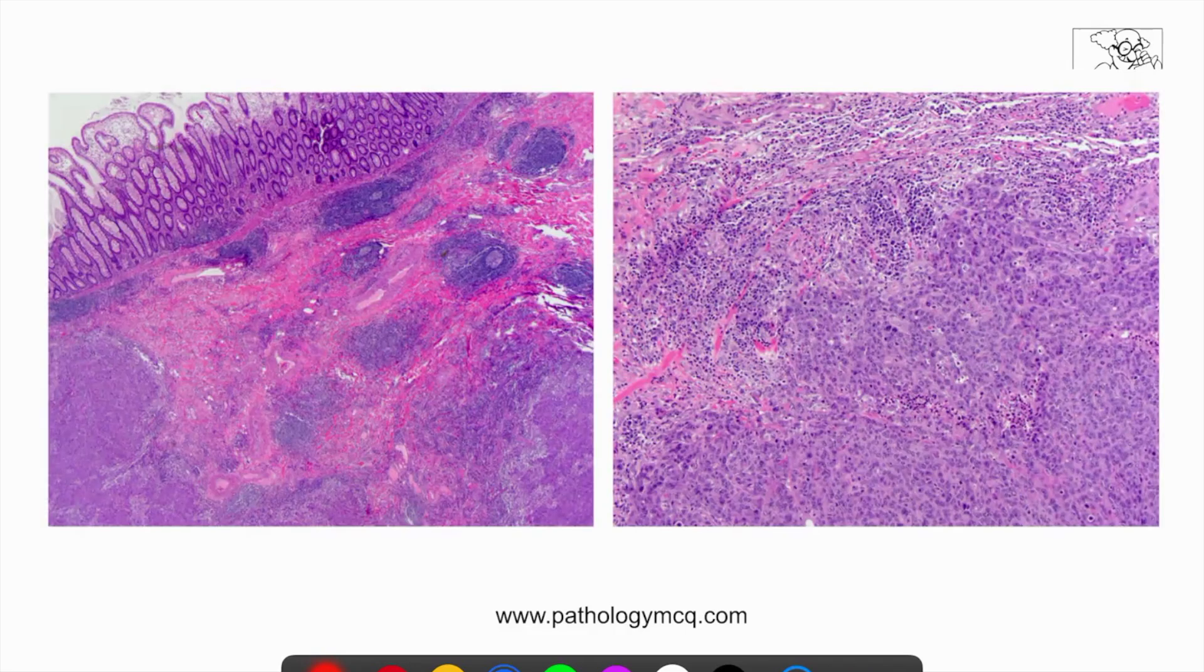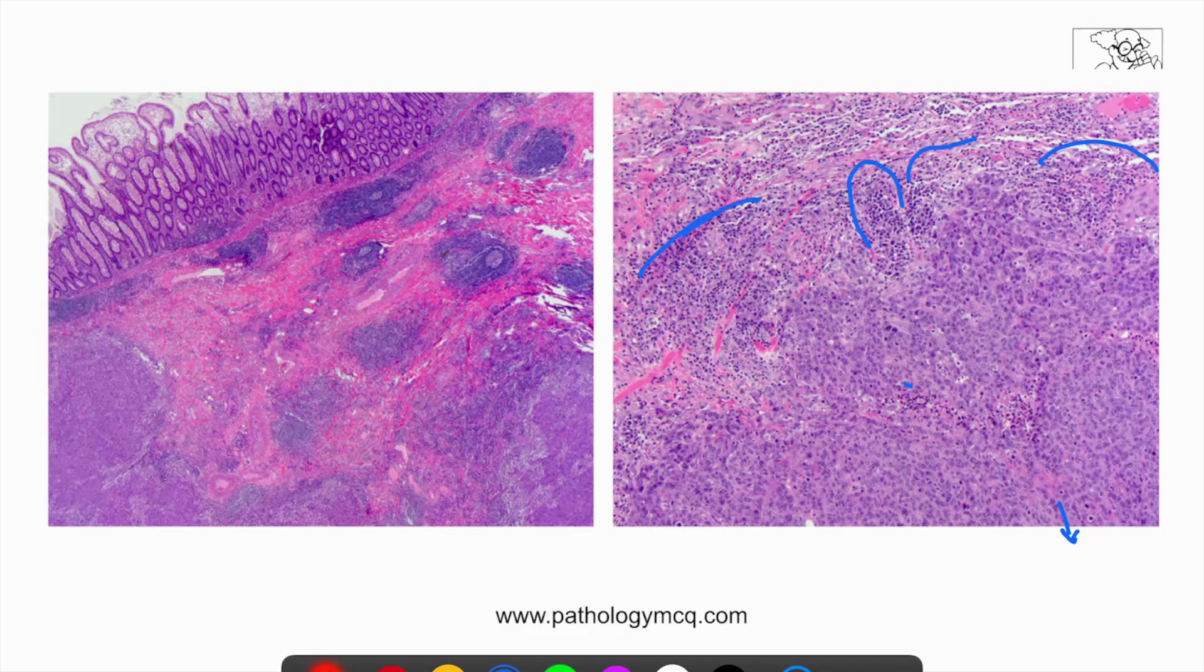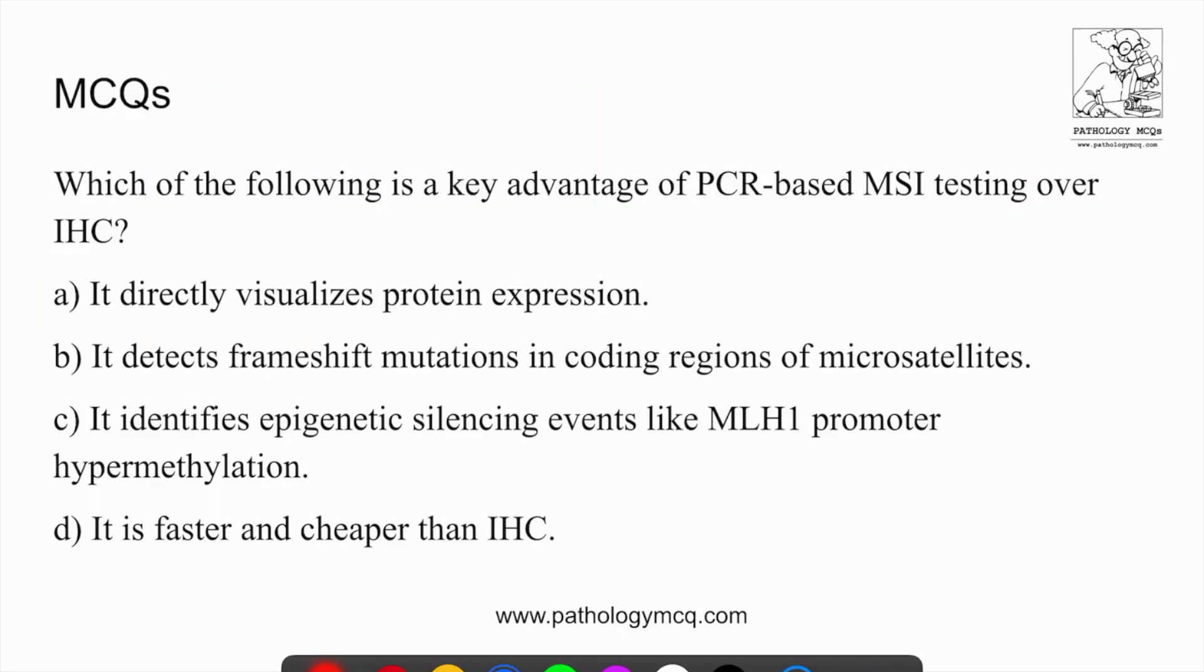And even more importantly, these tumors can be treated with PD-L1 therapy. As you can see here, this is an example of MMR deficient tumors, where you can see these tumor cells have a pretty much solid morphology. We know solid morphology correlates with a higher grade. And then here we can see that there's so many lymphocytes surrounding the tumor. So when PD-L1 therapy is given, a better response is there in these patients.